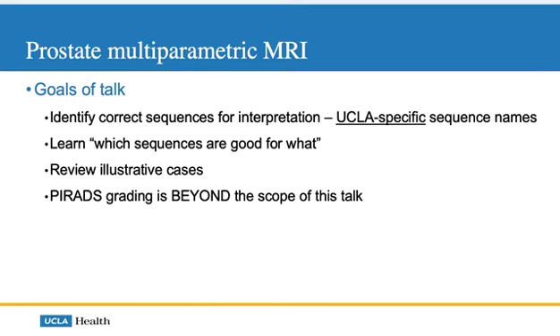practice. So the purpose of this talk is really to serve as an introduction to prostate MRI for clinicians and particularly urologists. It will help to introduce the correct sequences for interpretation, and we will focus on the UCLA specific sequence names that are of interest. We'll talk a little bit about which sequences are good for what. We'll review some examples and some cases.